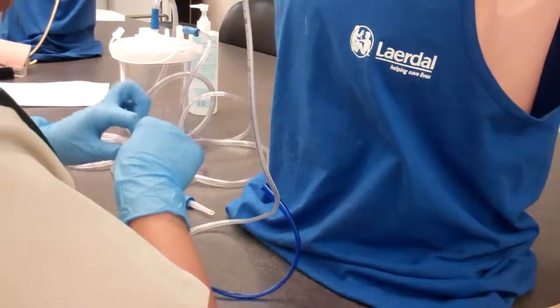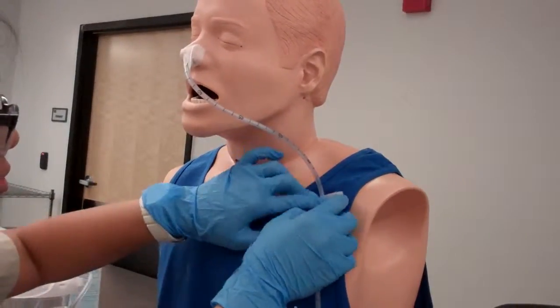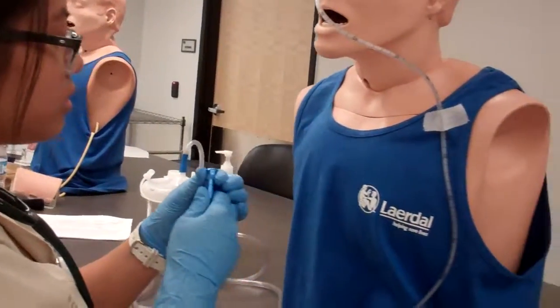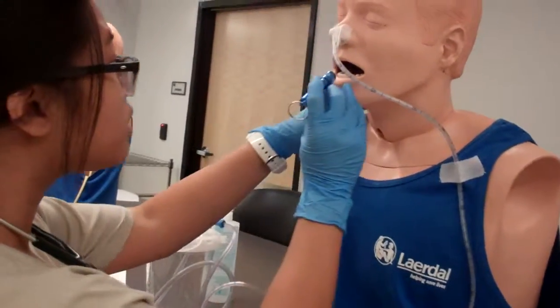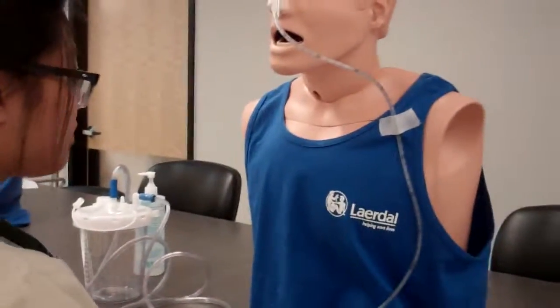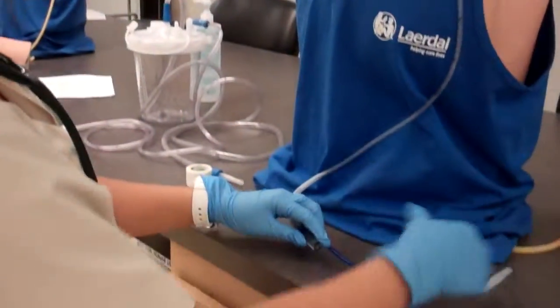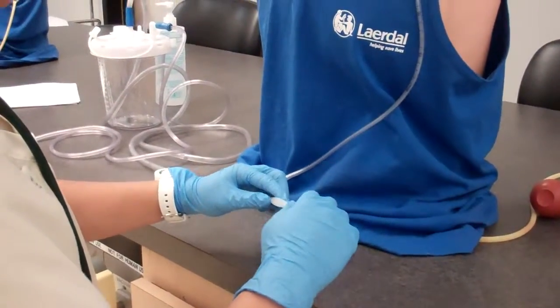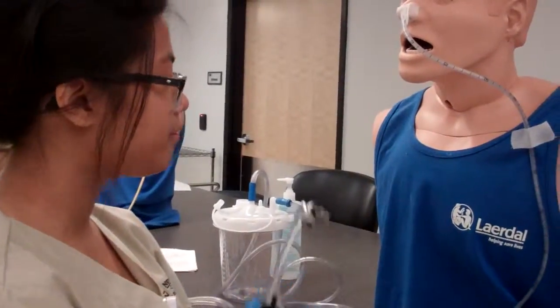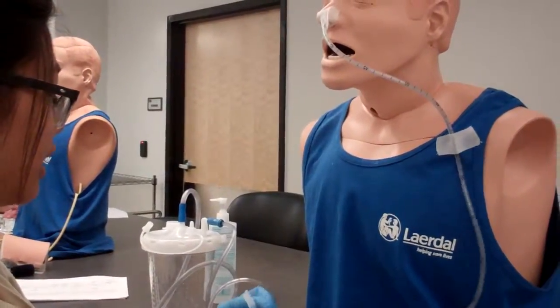So I'm going to tape it onto his shirt. I'm also going to check his mouth to make sure there's no kinks. And it's not coiled and there's no kinks. Okay. So for initial check, we would have you have an X-ray, Mr. Schumer, which we do have an order for you. And I would also check to make sure the pH is less than 5. And since I did get the okay that everything is in check, I'm going to go ahead and connect it to the suction.